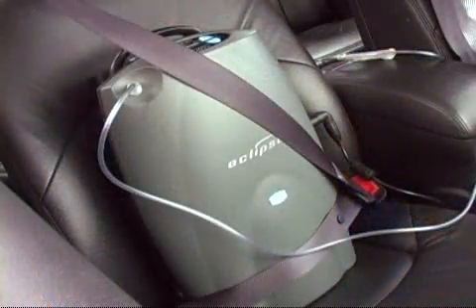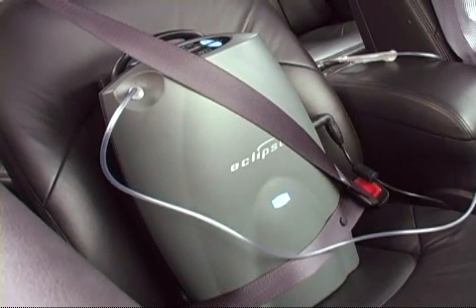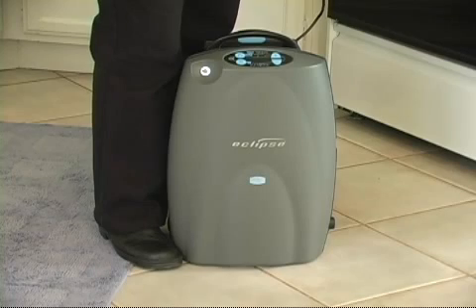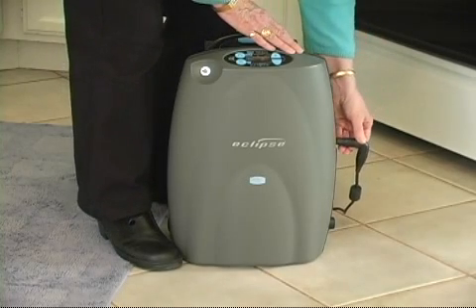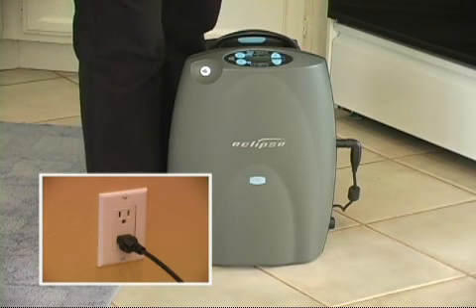Please note that your vehicle may not have sufficient power to actually recharge the Eclipse II's power cartridge while the unit is in use. As soon as you're back home, plug the Eclipse II into an AC outlet to replenish the power cartridge for your next excursion.